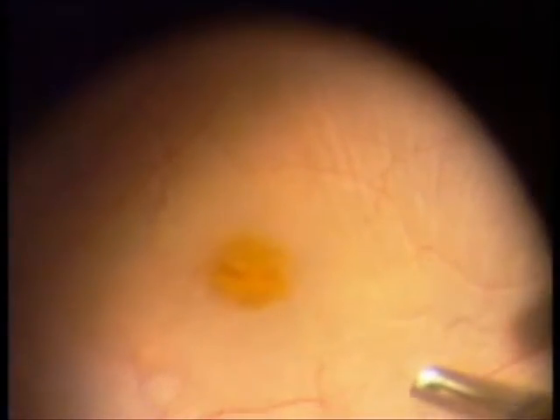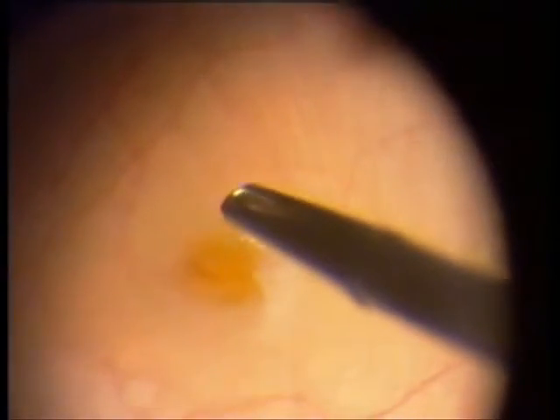And the final edge of the membrane comes through, and we can remove the whole membrane in toto.